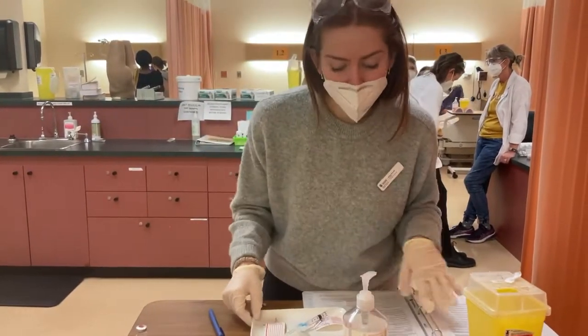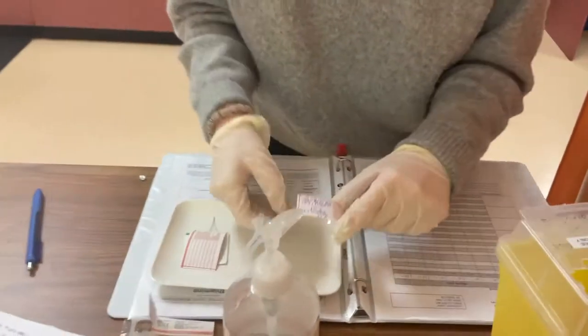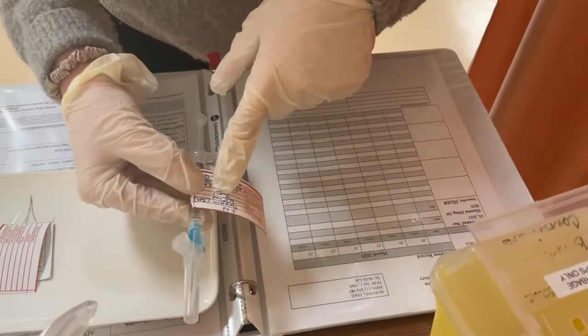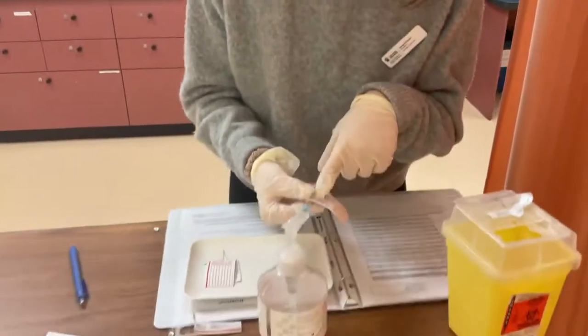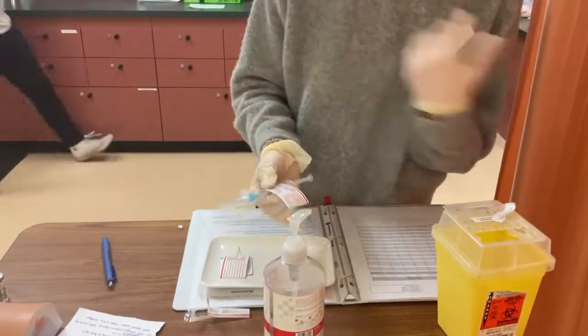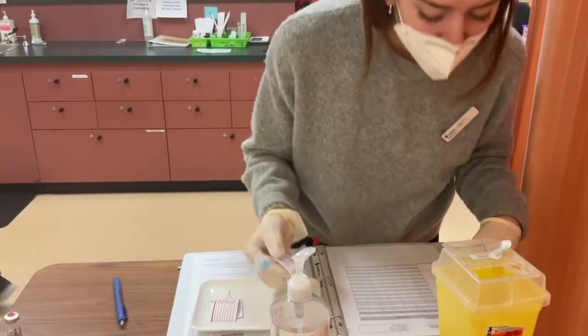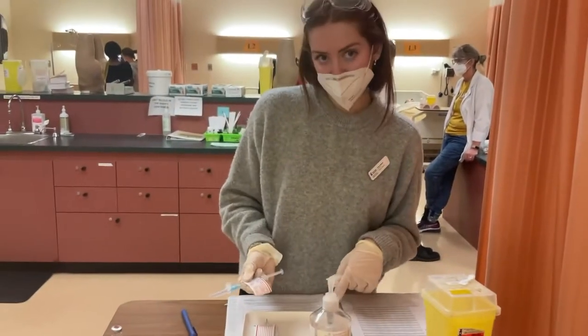Okay, so I'm going to perform my final check. It's going to be the medication and the MAR. So I have thiamine, 200 milligrams per 2 milliliters. Check the dose. 2 milliliters is drawn up. That's perfect. Intramuscular. I will make note of what deltoid I use. Twice a day. I'll be giving it in the morning. For the right reason, for his Wernicke's encephalopathy caused by vitamin B1 deficiency.